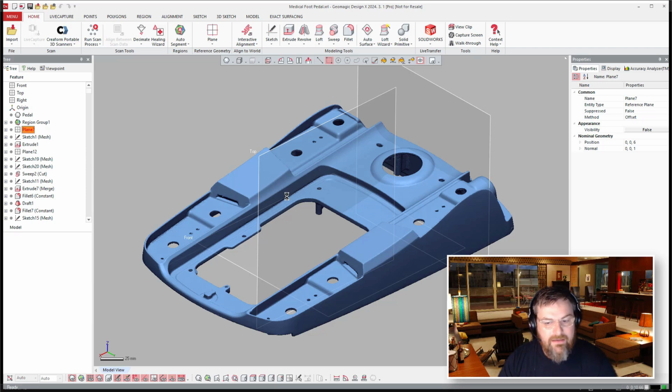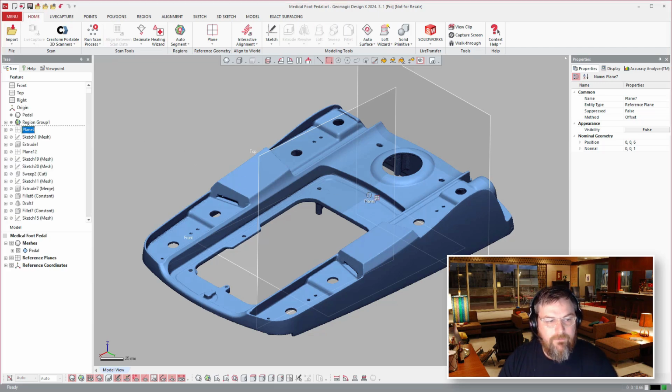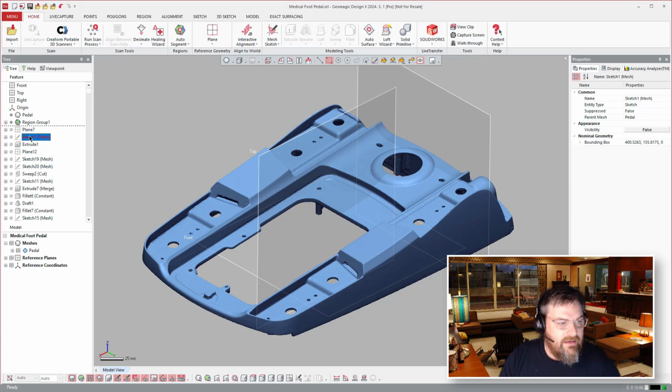If I roll back, and sometimes it takes a second for it to recalculate, now you'll see that just after the region group, we'll walk through the approach that was taken to model this part. And every one of these models that I've selected highlights some neat features that are within Design X. So let's get rolling here.